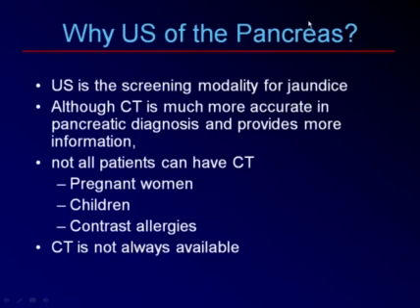So why do ultrasound of the pancreas? Well, first of all, ultrasound is a screening modality for jaundice. So any patient with jaundice should first get an ultrasound. So that's a good place to start, and at least to look at the head of the pancreas.